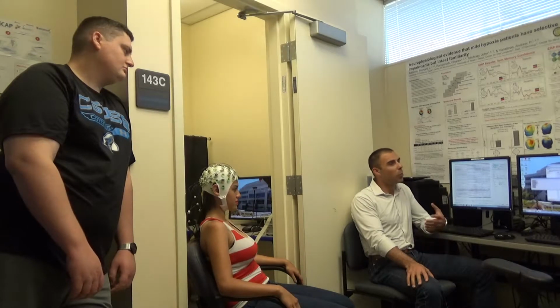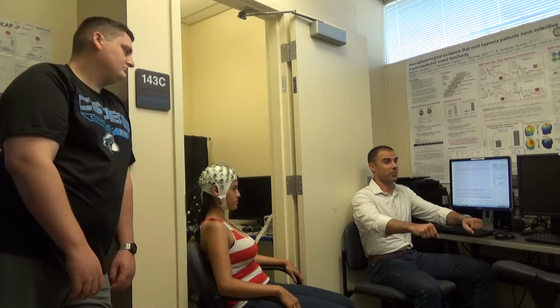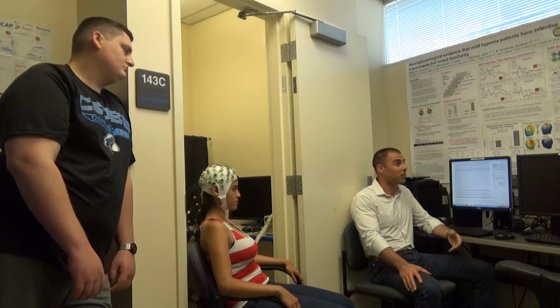So you have to be really careful when you're explaining to participants and working with them through the expectations of the experiment, because we do want them to stay very still. But that doesn't mean rigid, sitting there like a statue, because then you get to see that type of activity. And that's also something you're going to have to spend time cleaning later. I don't think anybody likes to clean a mess that they can avoid making in the first place, right? So you can save yourself a lot of trouble on the back end by cleaning that up on the front end. Part of that is just really good instructions for the participant, but also you staying very vigilant as an experimenter and keeping an eye on the data.